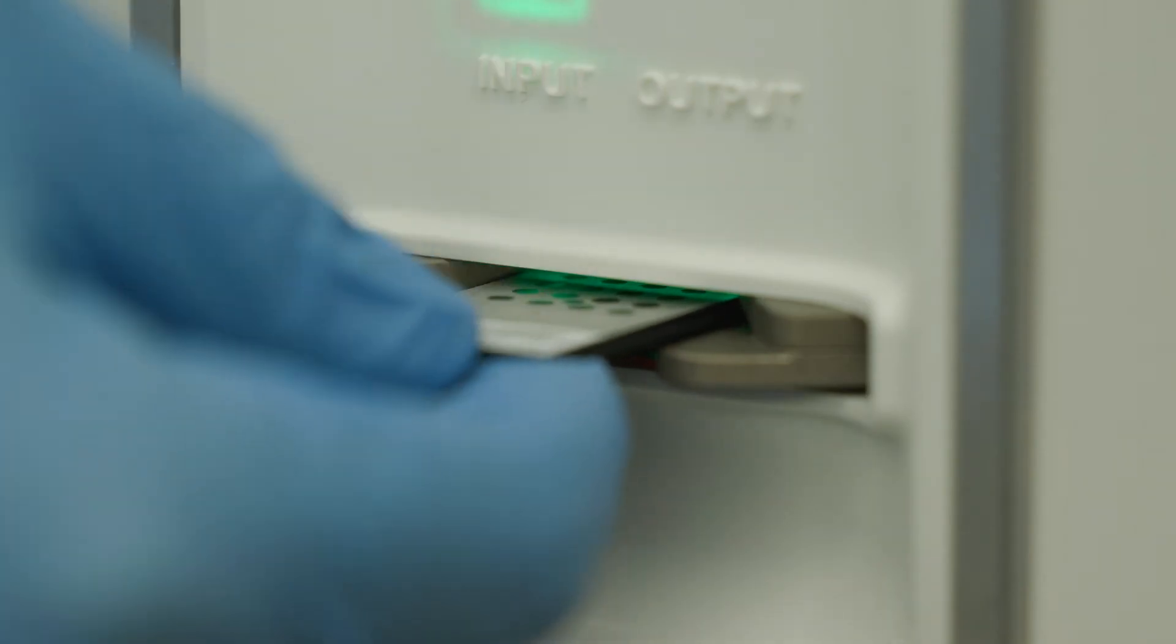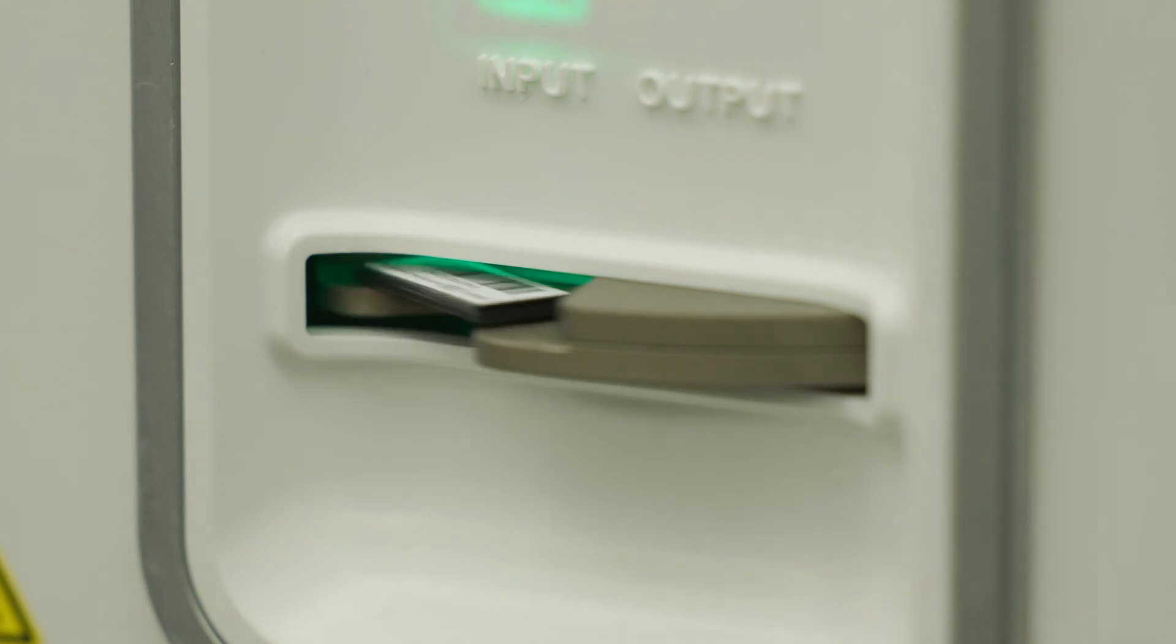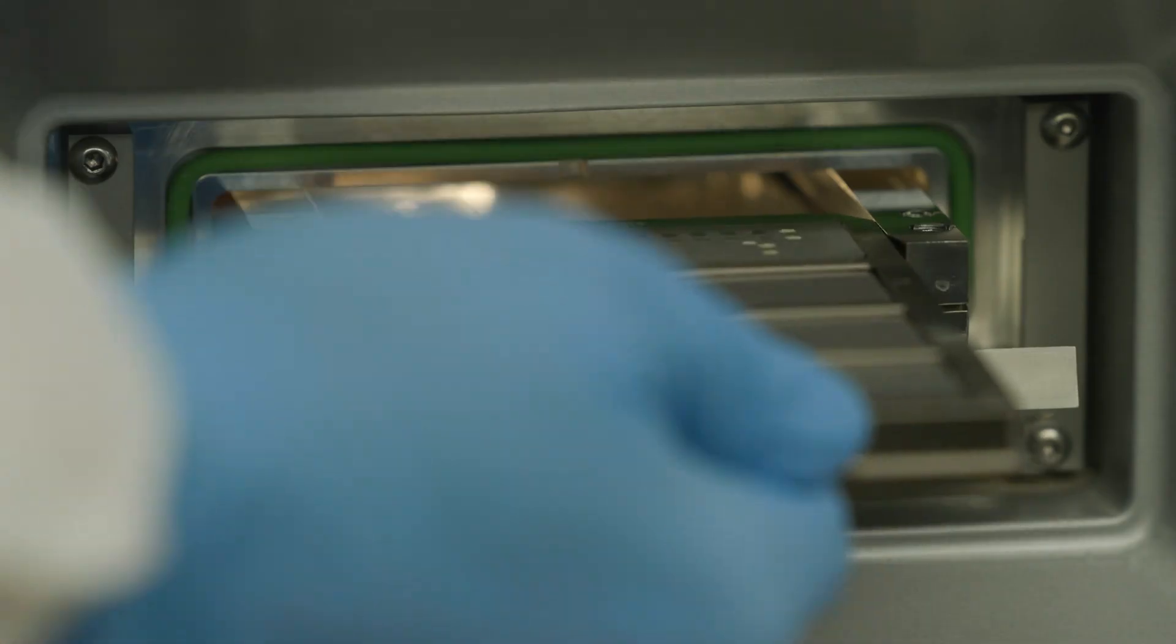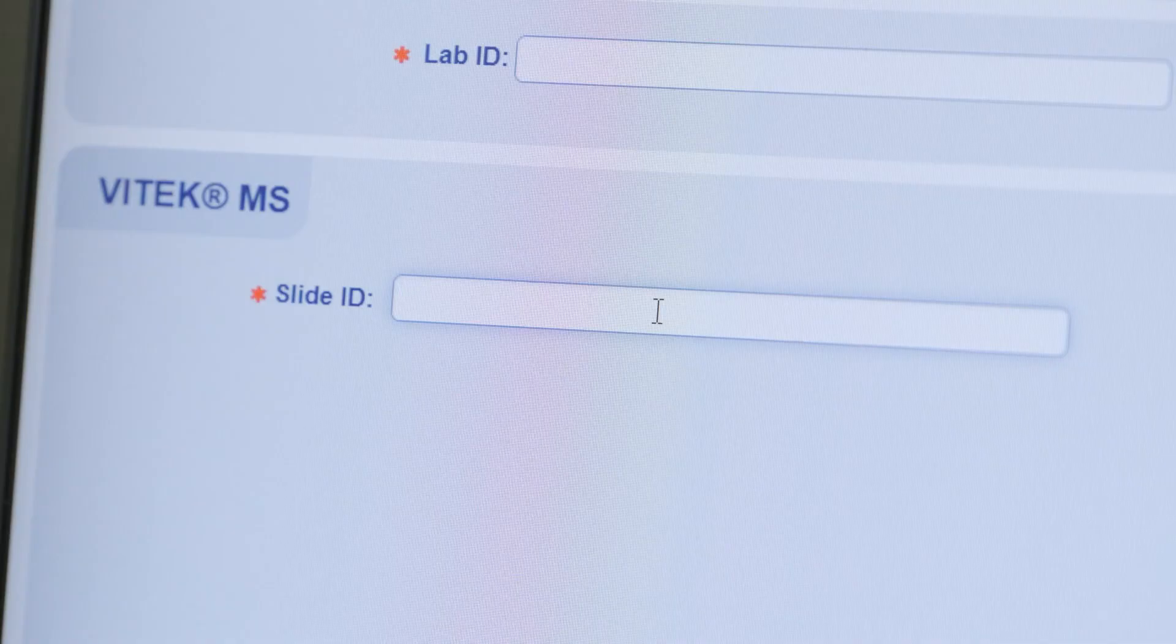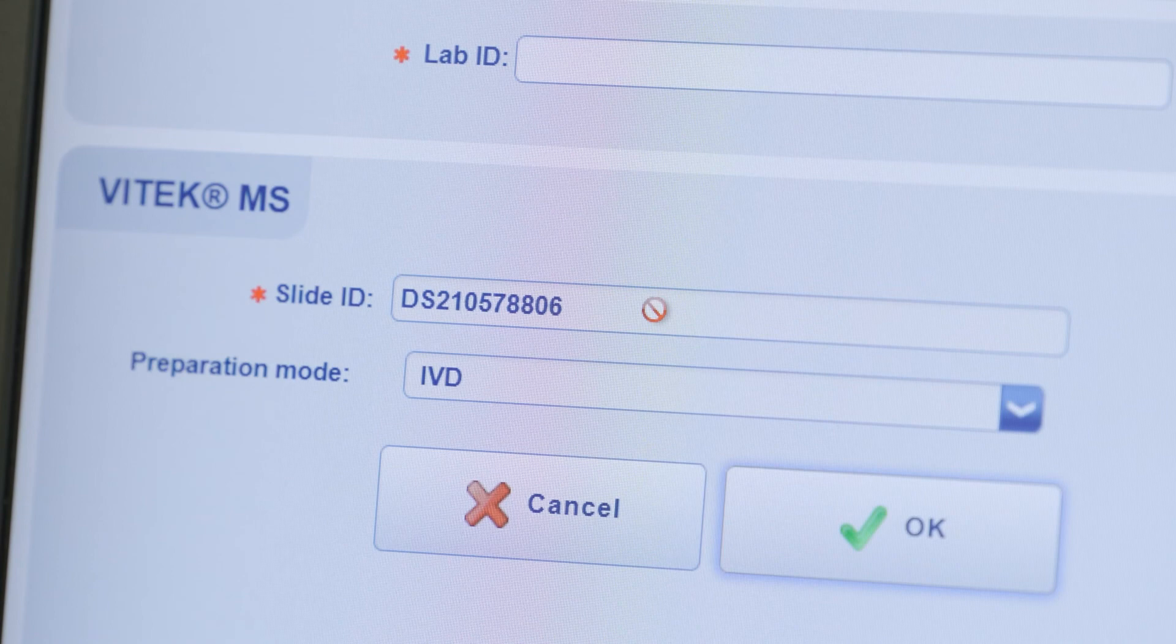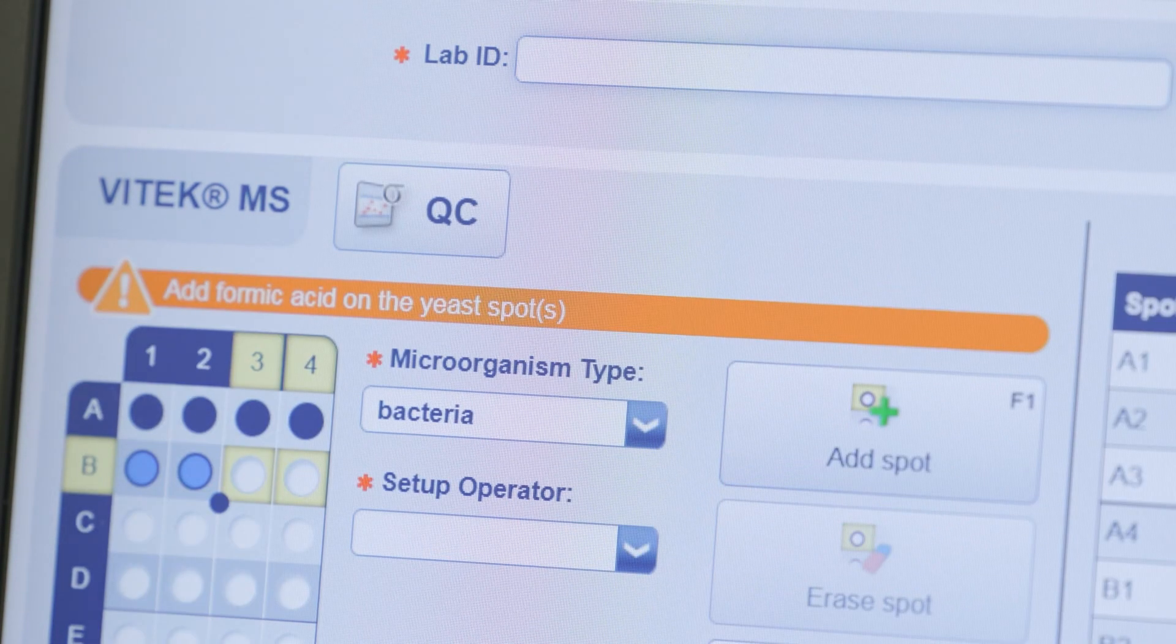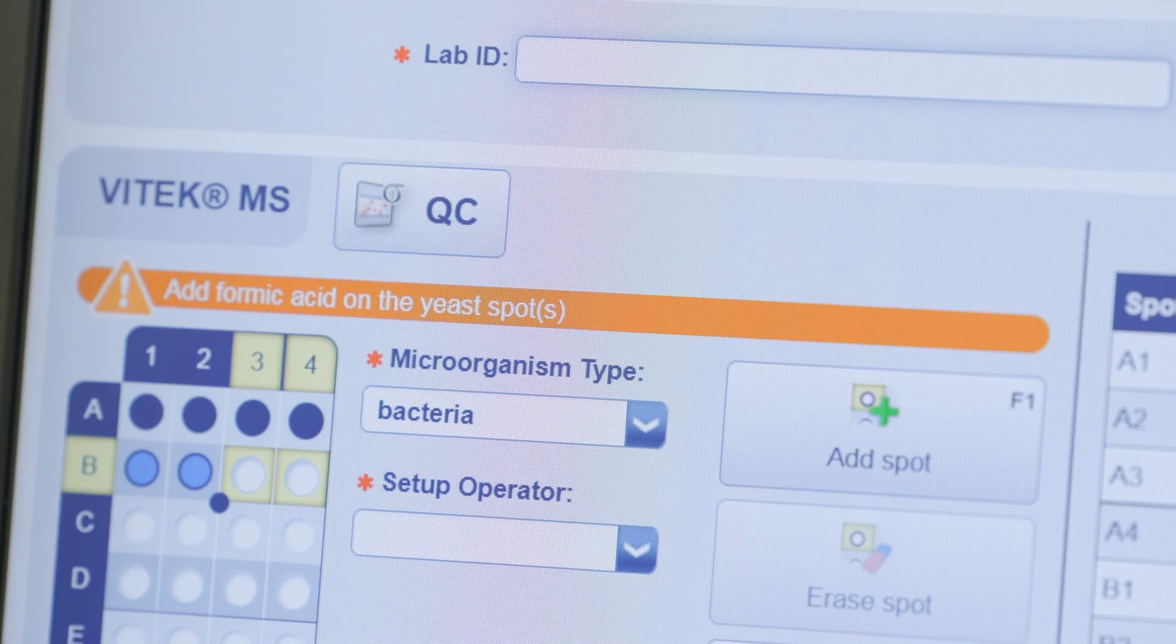The prepared slide can now be loaded on the instrument provided all spots on the slide are dry. It is also possible to reopen the slide for later completion of the acquisition group, providing it has not been acquired.